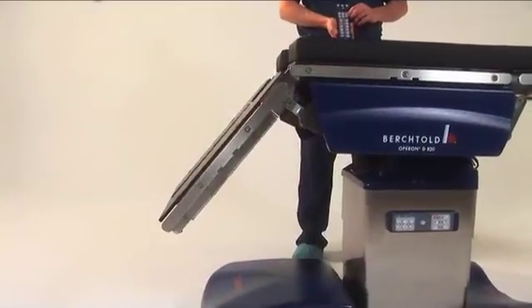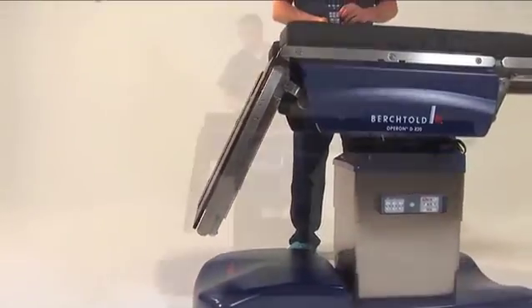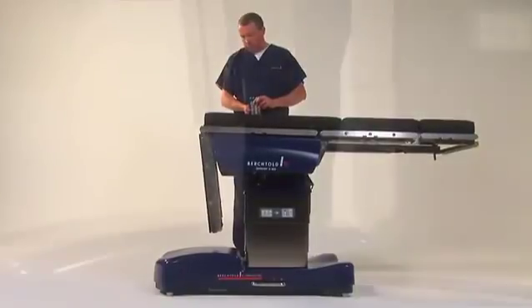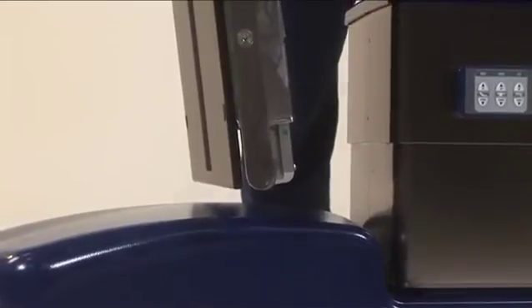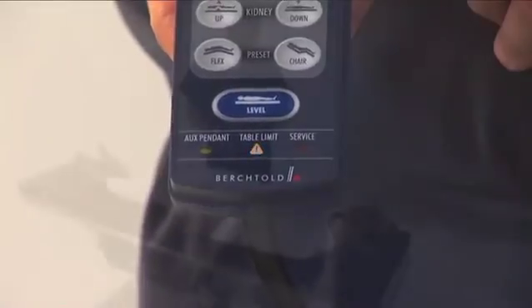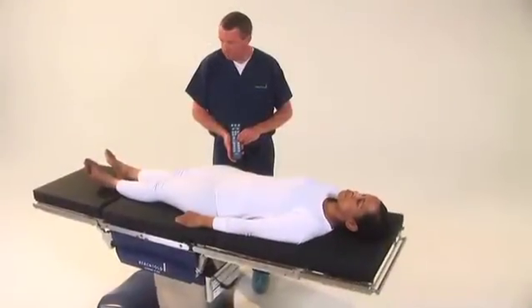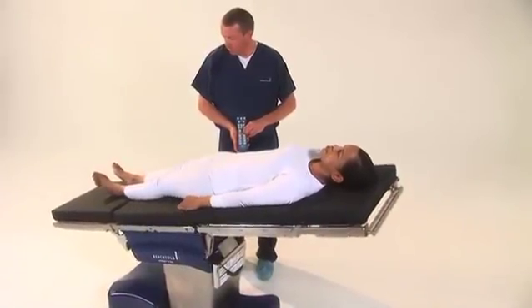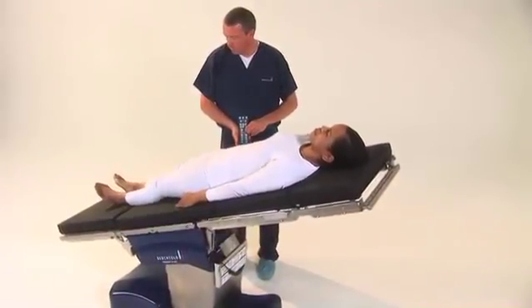The table's software includes anti-collision intelligence. For example, if the leg section is lowered to 90 degrees and the operator attempts to lower the table simultaneously, sensors will detect a potential hazard and halt the movement. The table monitors all relevant tabletop positions. These include the leg section, the back section, the head section, height, Trendelenburg, reverse Trendelenburg, and tilt.